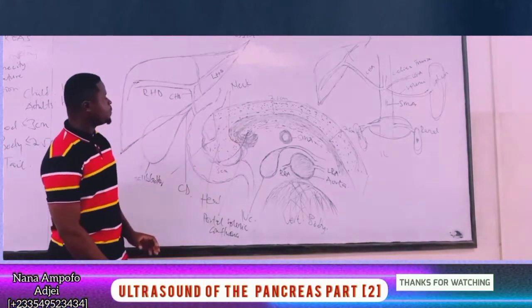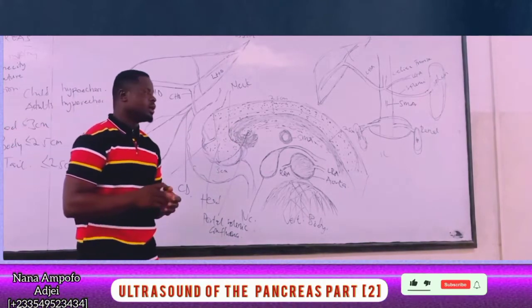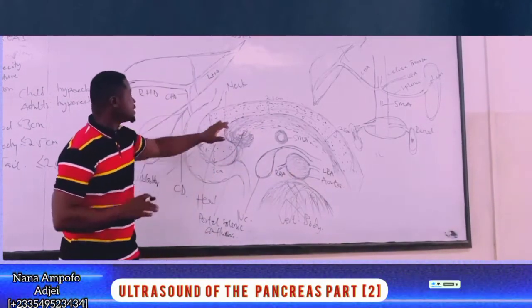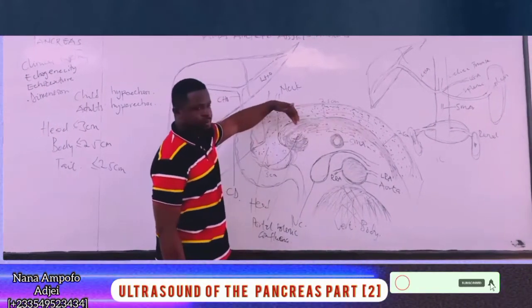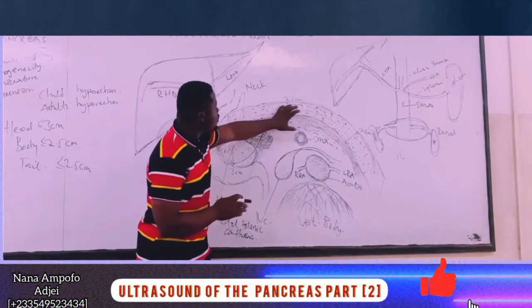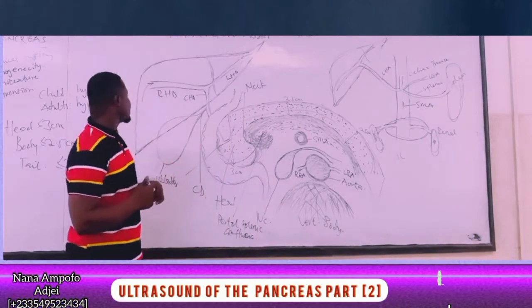Duodenal obstruction. And then we also have pancreatic divisum, where we have a shortened main pancreatic duct. So instead of the longest one that we have, it is very short. In that case, it only drains the head of the pancreas without draining the entire pancreas. That is pancreatic divisum.